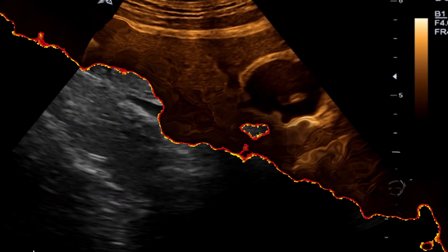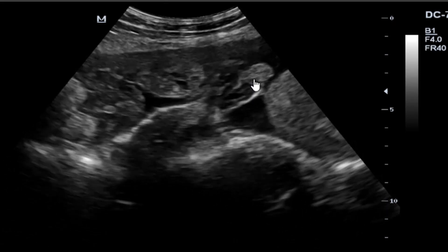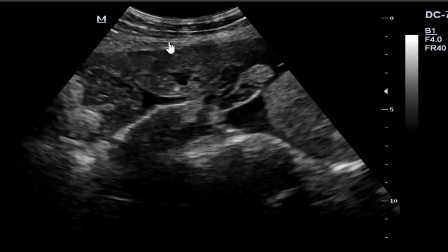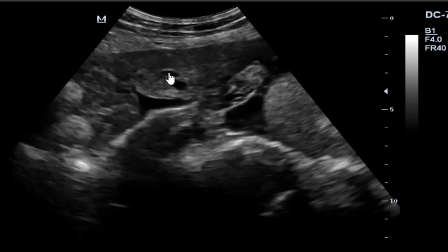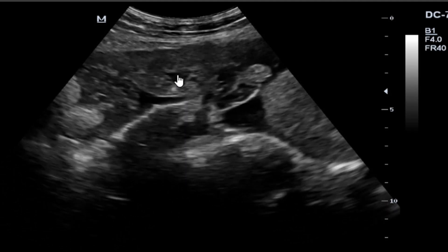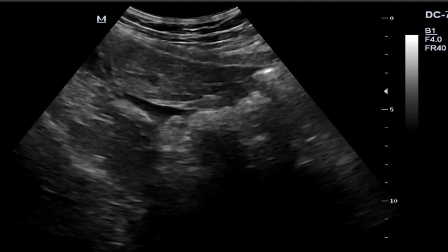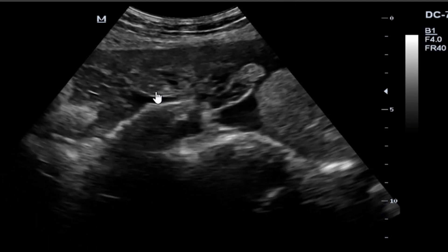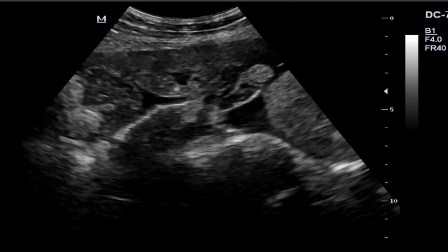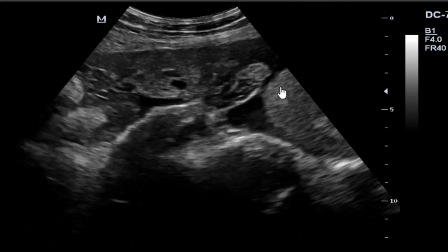Right around here, what you are appreciating is the right adnexal origin. In the right adnexal region you can actually see this — this is actually looking like part of the abdomen of the fetus. You can see this in this region; it didn't have any flow on Doppler. This is part of the fetal remains.